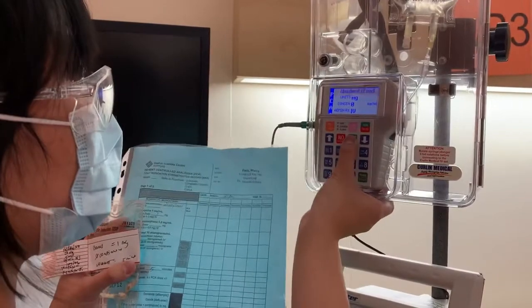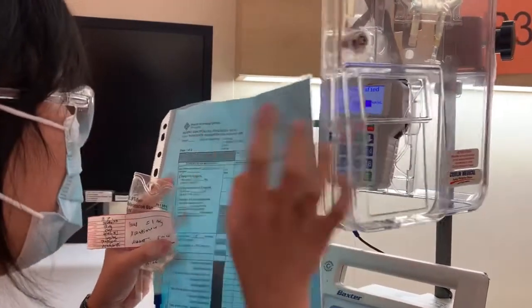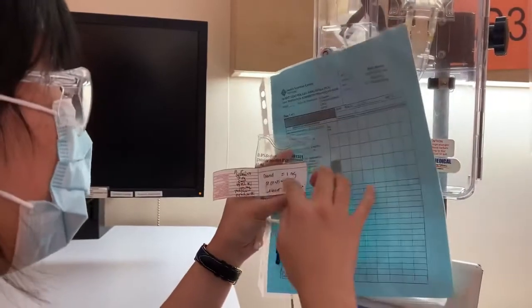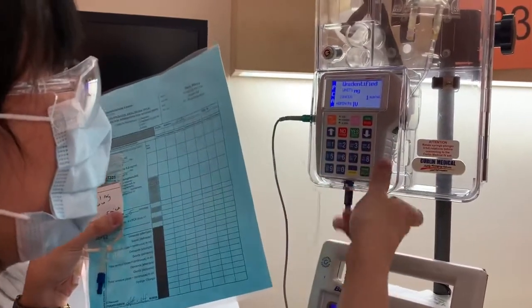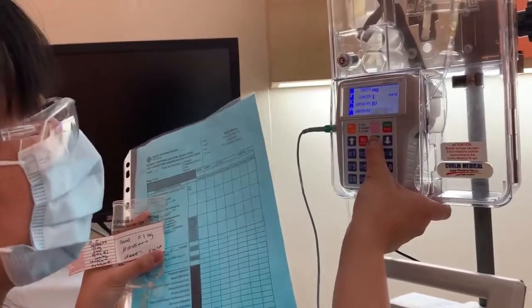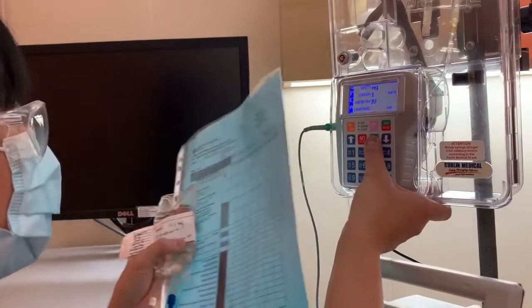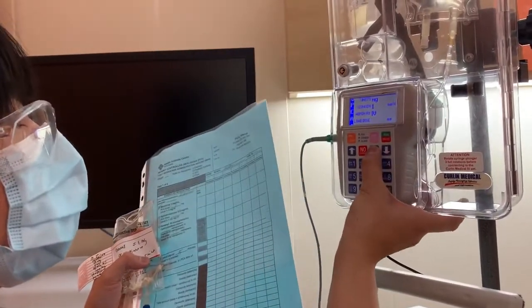So hit yes. And the concentration that we need is 1 milligram per mL, and it also says 1 milligram per mL in here. So that is correct. So we're just gonna put 1 in here and put yes. Enter. We're doing it via IV. Loading dose, we don't have any in our order. We're checking here as well, so we're good. So we just hit yes.